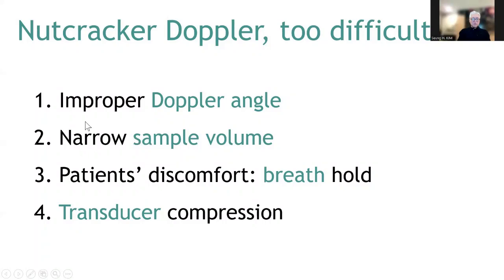If we use a narrow sample volume, it will be difficult. And the third issue is patient breathing. If we ask the patient to hold breath repeatedly, the patient feels exhausted, and we may have difficulty getting the patient's cooperation.